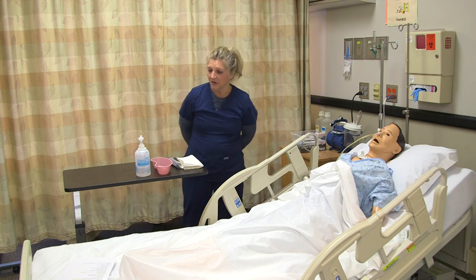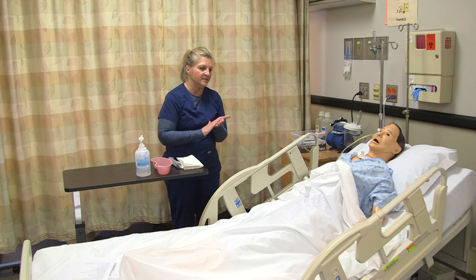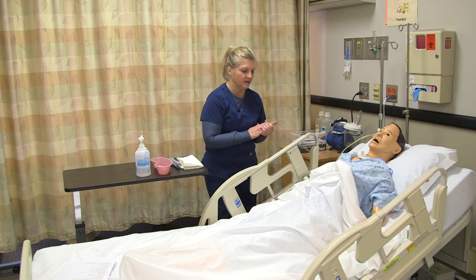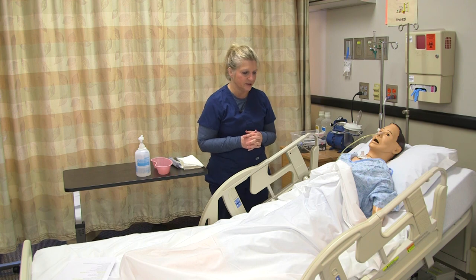I go into my patient's room. As always, we want to make sure that we introduce ourselves, wash our hands, provide for privacy, and we also want to make sure that we have the correct patient using our identifiers against our medical record and also check for any allergies.